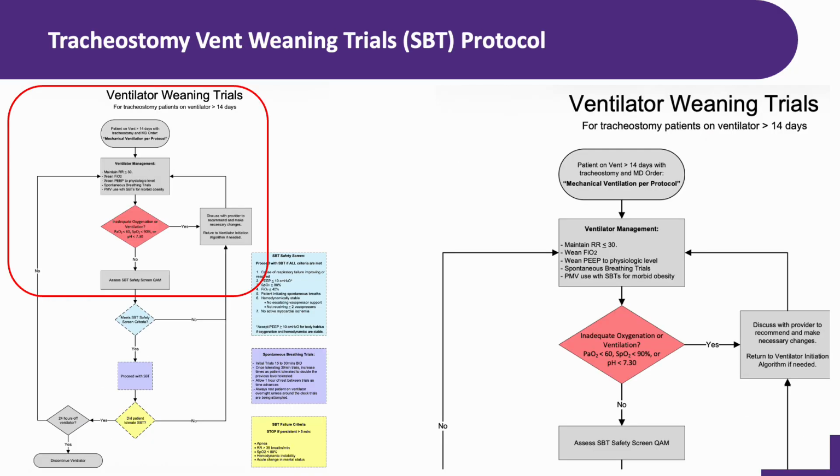Okay, now we're moving on to our third protocol, the tracheostomy ventilator weaning trials protocol. This applies to a very specific patient population, our tracheostomy patients who have been on the ventilator for greater than 14 days. These are our chronic, complex, long-term ventilated patients that need a different approach than our acute patients. Look at the flowchart on the side. The standing management for these patients involves several key elements that you are maintaining on an ongoing basis. Pressure support to maintain the respiratory rate below 30.